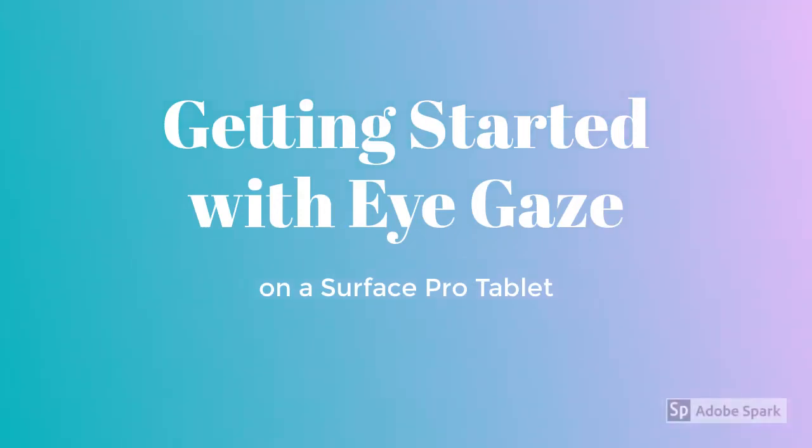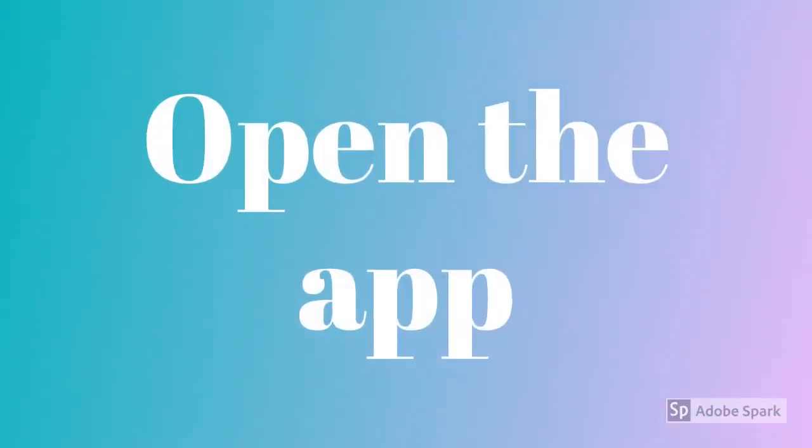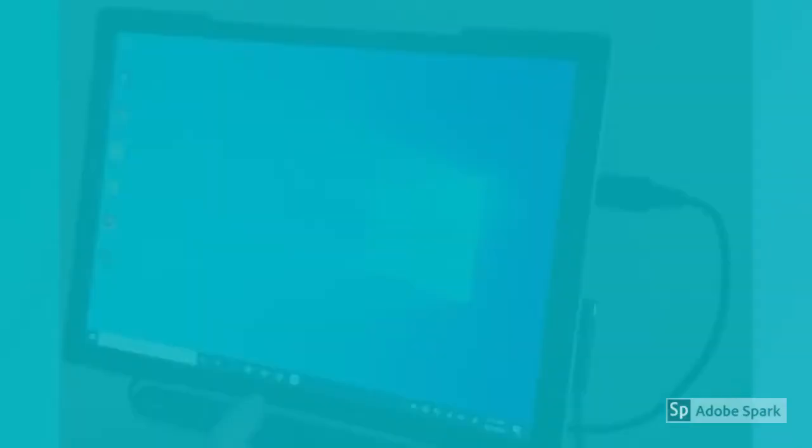Now that you've set up your eye gaze system, it's time to get started. First, you need to open the app. We'll be using SnapCore first, but there are many other communication apps that could be used.